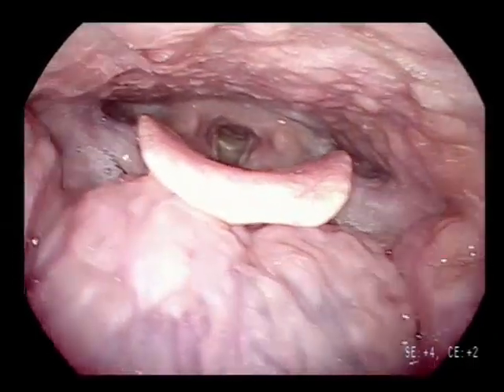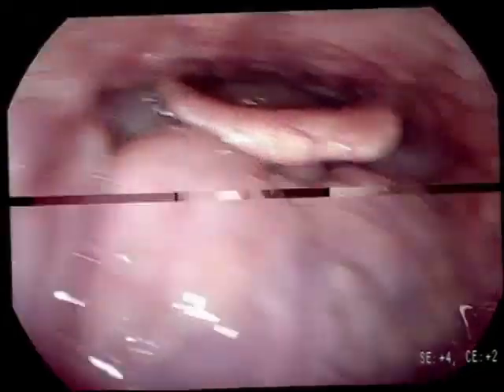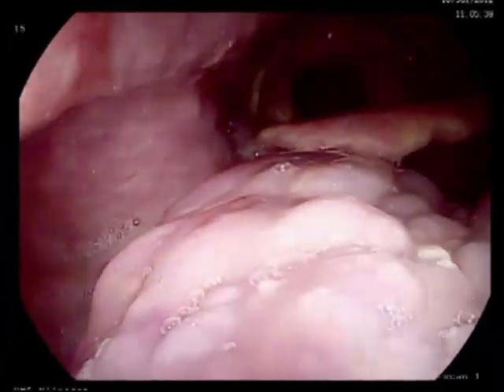When examining the oropharynx, move the endoscope from left to right and let the patient stick out the tongue to adequately visualize the vallecula.